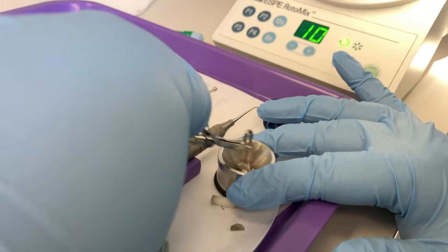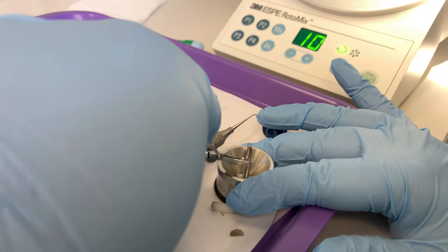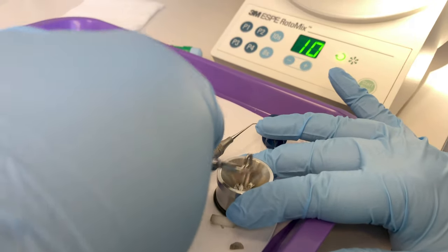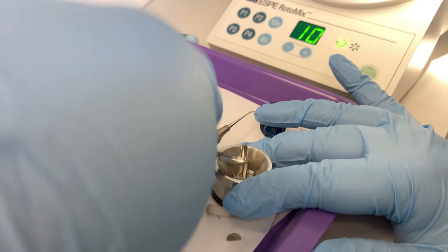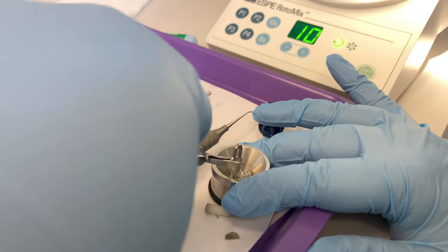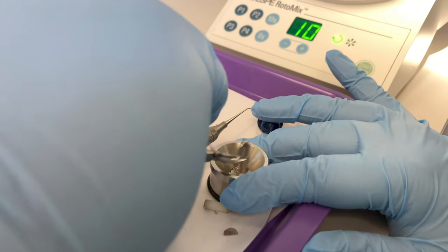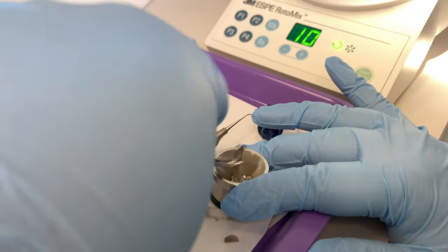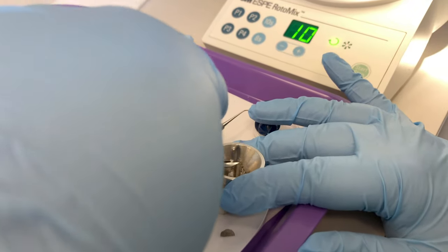Then you can load your carrier. Now this mix is a little harder — this is an older amalgam. You can see how crumbly it is; it's not shiny. At school we don't go through these very often, so we don't get to use them up before they expire.